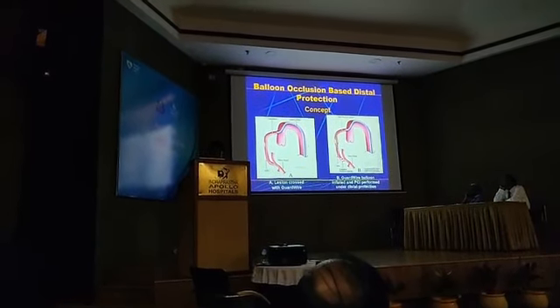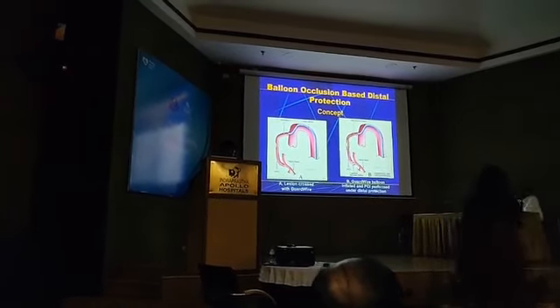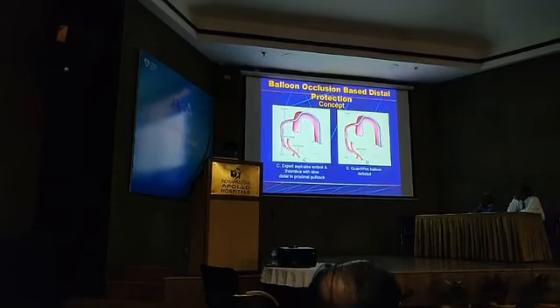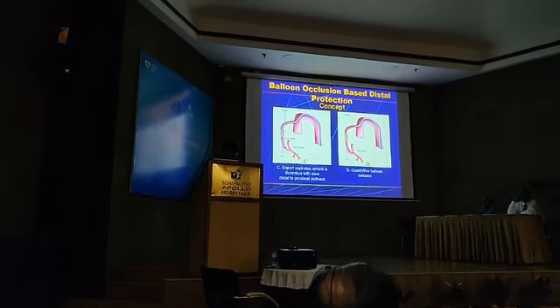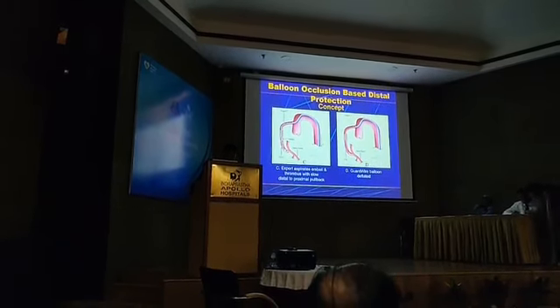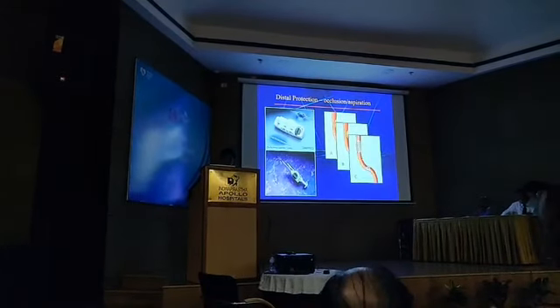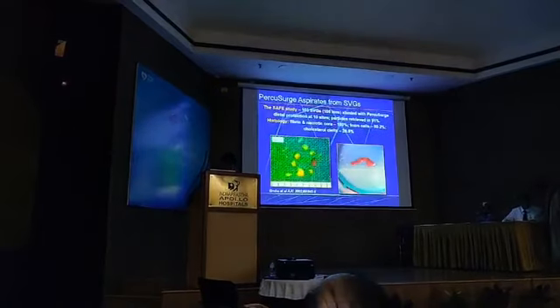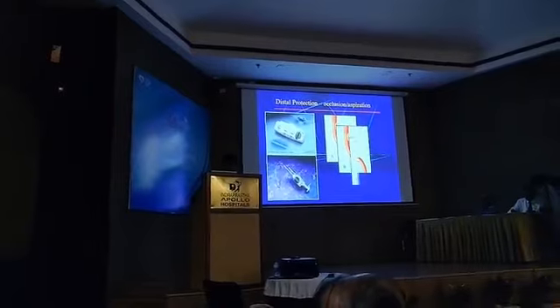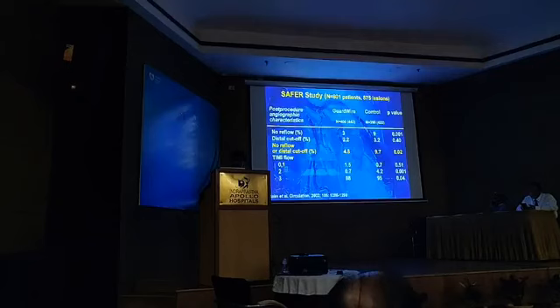The concept is that you distally occlude, and then you perform the balloon inflation and the stent implantation, and then remove the distal protection device, and the flow is resumed. Of course, we have to aspirate whatever is there, the aspiration of the emboli. This is how it works with the PercuSurge distal protection device, and you can see the figures. First, the distal balloon inflation, then performing the angioplasty, then putting the stent, and this is the distal protection device.